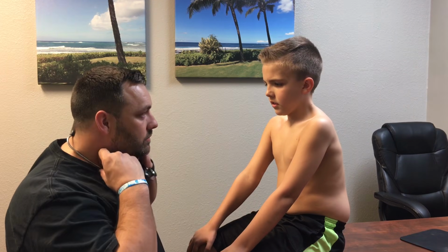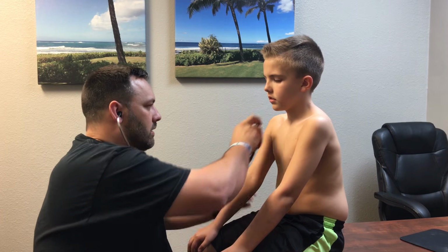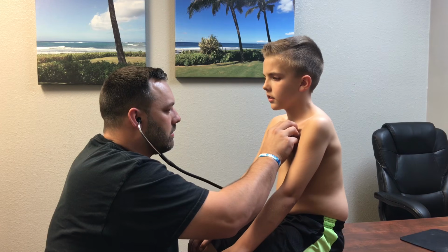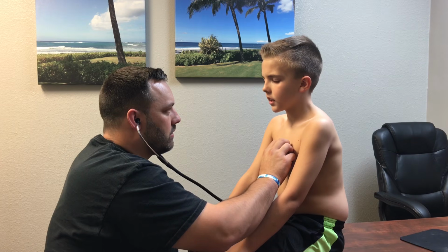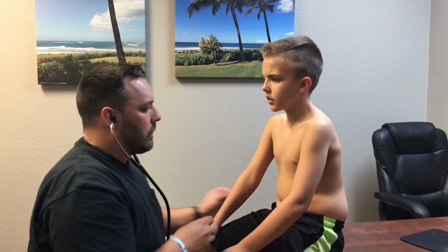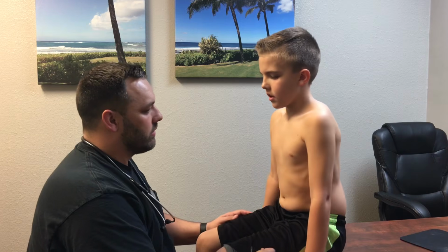the bronchophony, and so we're going to say 99 while I listen as well. So every time I touch your chest, say 99, okay? 99. 99. 99. Say it again. 99. Okay, and I could hear that equally bilaterally through the lung fields, and so I don't believe that there's any cause for concern there. Okay, you doing all right?